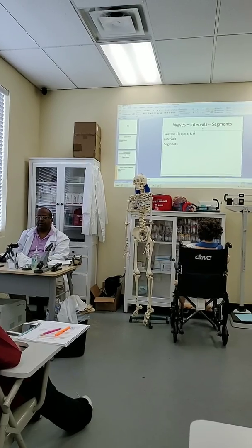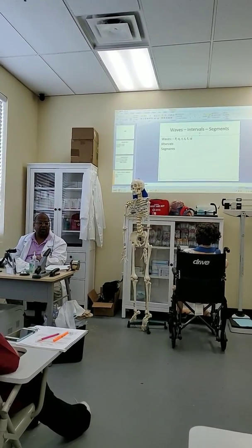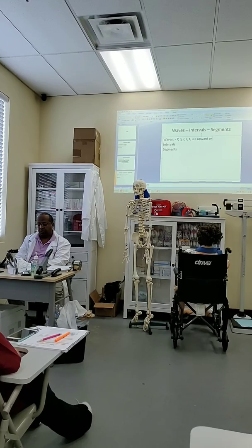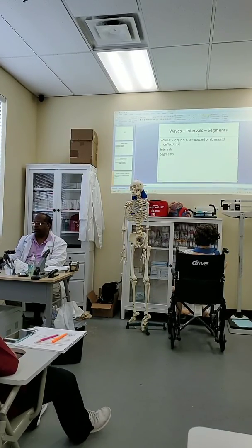What do you mean by waves? Well, when we define waves, waves are either upward or downward deflections. These are upward or downward deflections.